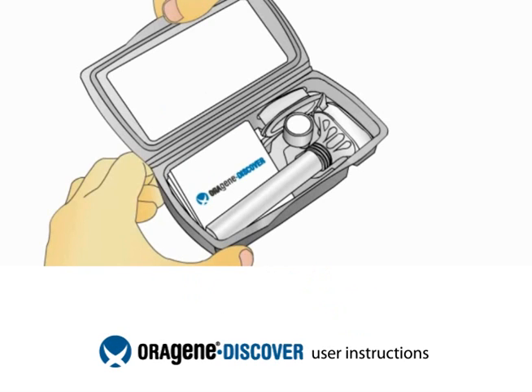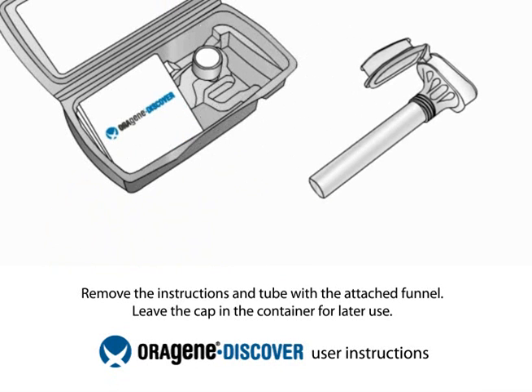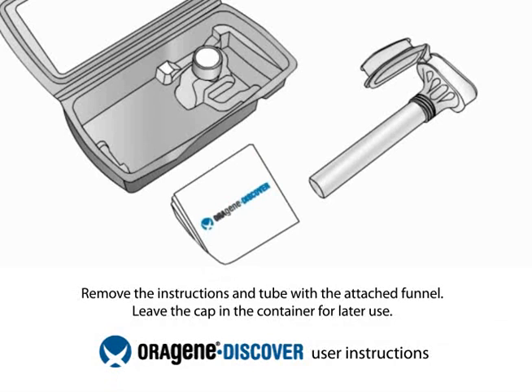To use the collection kit, open the packaging. Remove the instructions and tube with the attached funnel. Leave the cap and container for later use.